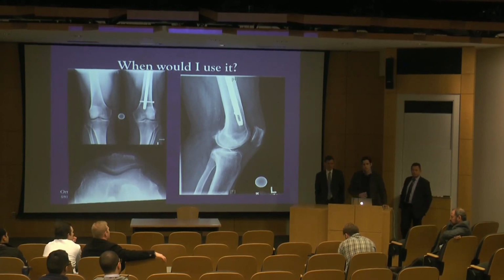I think in situations where you have severe deformity, where you have to compromise because maybe making a cut that's perpendicular to your mechanical axis in the tibia is going to greatly destabilize the lateral compartment or the lateral soft tissue structures in the knee, that's when I feel that navigation wins this fight. That's where you can change the plan or decide ahead of time that maybe I'm going to leave my tibial component in 2 degrees of varus, which I think would be acceptable as not falling into an outlier category, and yet not be so devastating to the soft tissue balancing question.